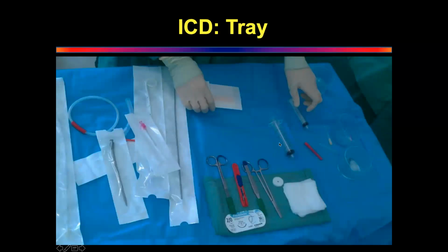One is for local and one is for aspiration. Well done. Stop. Yes. Stop. Don't do anything more.